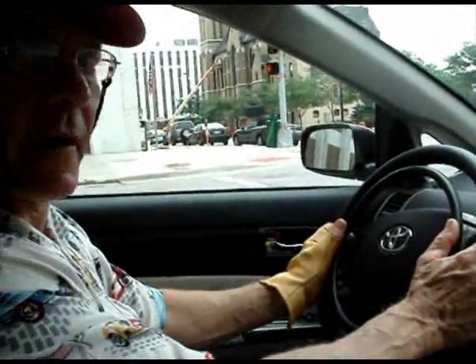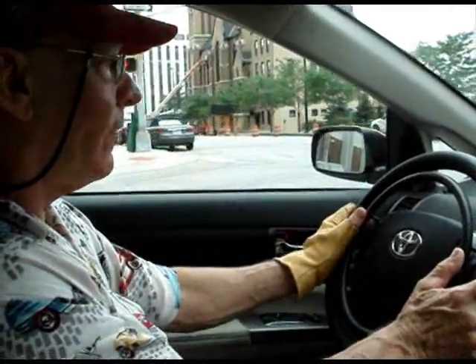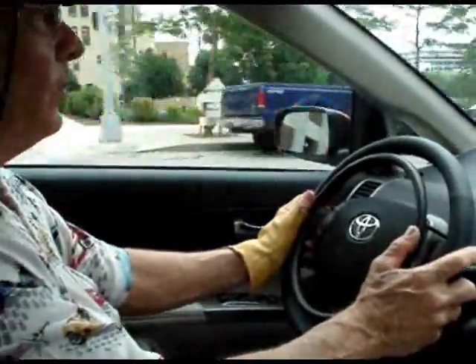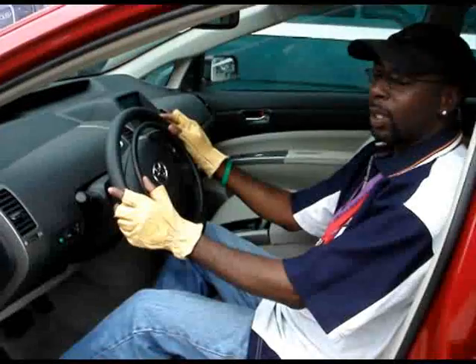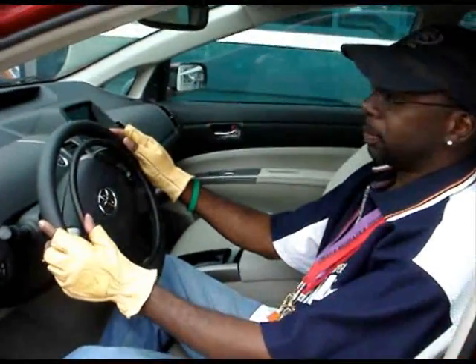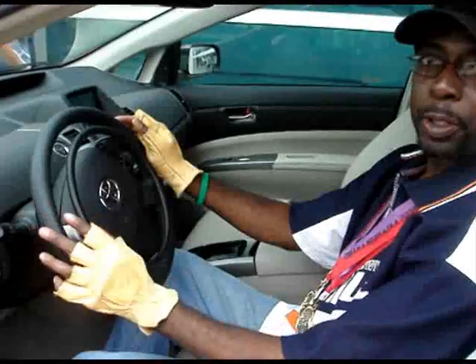It takes very little time to acclimate yourself to this system. I was surprised — I thought it would take longer, just a little bit of doing to get used to. I thought the digital ring was very easy to maneuver, how it easily turns when you're turning also.